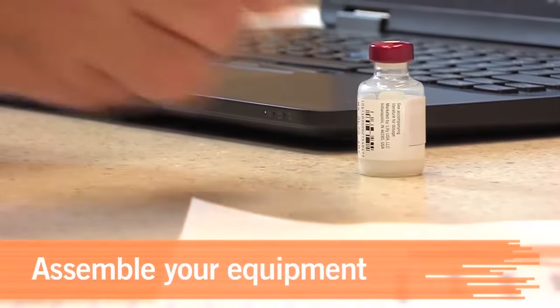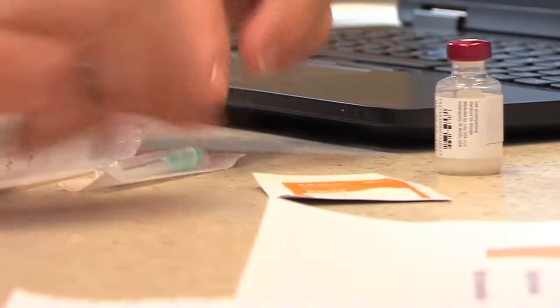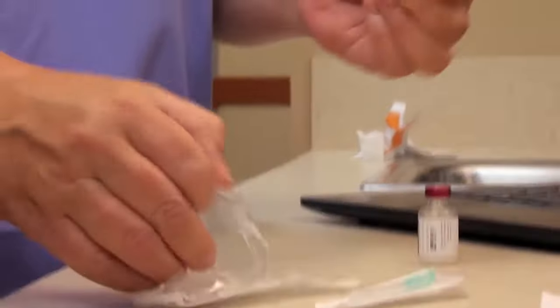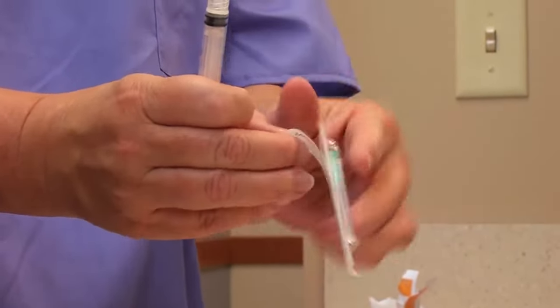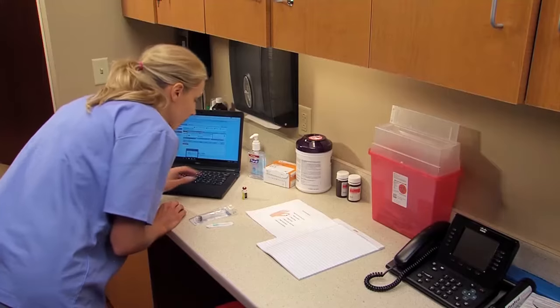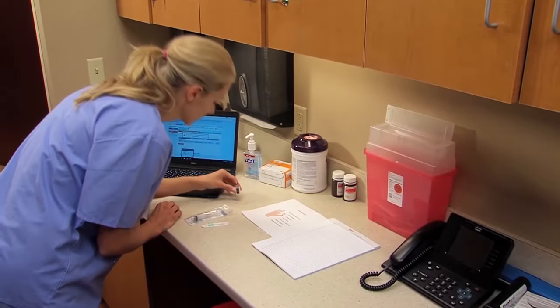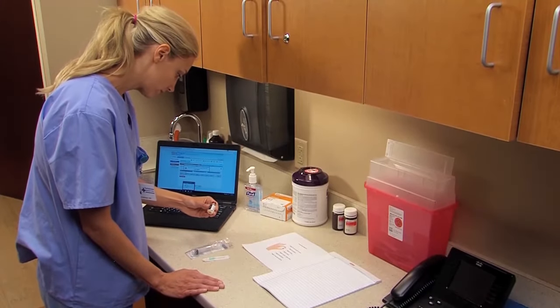Assemble your equipment. Be sure to choose the correct syringe and needle unit based on the administration site, the patient's characteristics, and the amount of medication to be injected. Remember, you have the rights to prevent errors. Compare the order with the label on the medication vial once more just before dispensing the ordered dose.